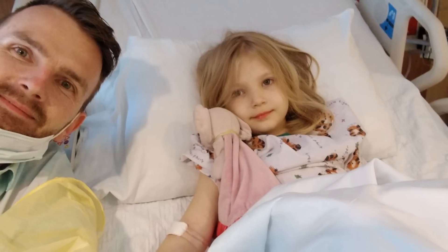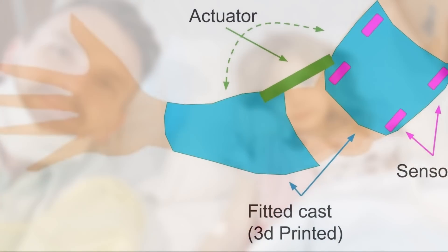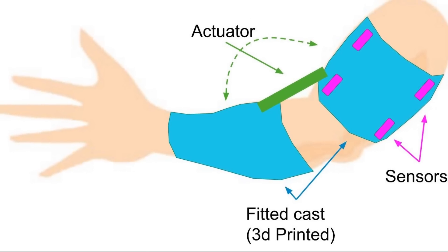We have a really exciting update this time. Just to recap: at the beginning of summer, my daughter's left arm was paralyzed, so we decided to build a robotic prosthetic arm to help her move. This is an update on that project.